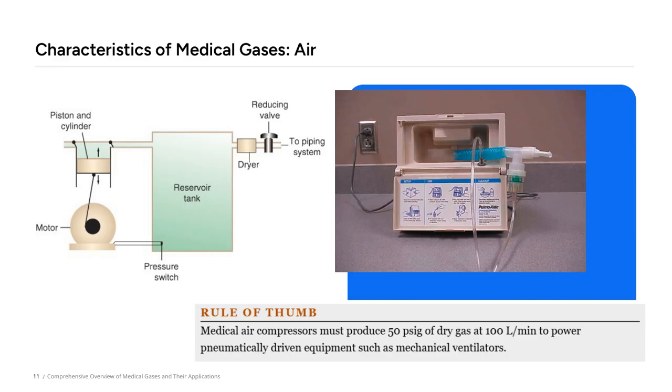In medical settings, we use medical air to provide clean, breathable air for patients who need respiratory support. It's specially filtered and compressed to ensure purity and safety. Because air is essential for respiration, understanding its characteristics helps us ensure it meets the necessary quality standards for clinical use. Overall, while air might seem simple, its proper preparation and understanding are vital for effective patient care. It's a fundamental component of many respiratory therapies and equipment, underpinning the safe delivery of oxygen and other treatments.